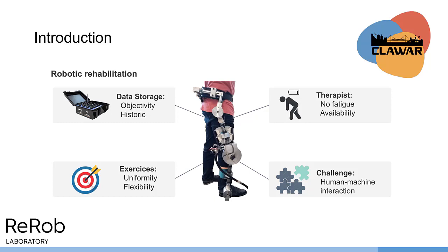With this new technology, data collection through sensors plays a crucial role, providing a detailed history of the exercises performed. This important information improves the analysis of therapeutic progress over sessions, allowing for a more accurate prognosis regarding the therapy's evolution. However, when considering the use of robots in rehabilitation, it is imperative to highlight the importance of interaction between patient and robot.